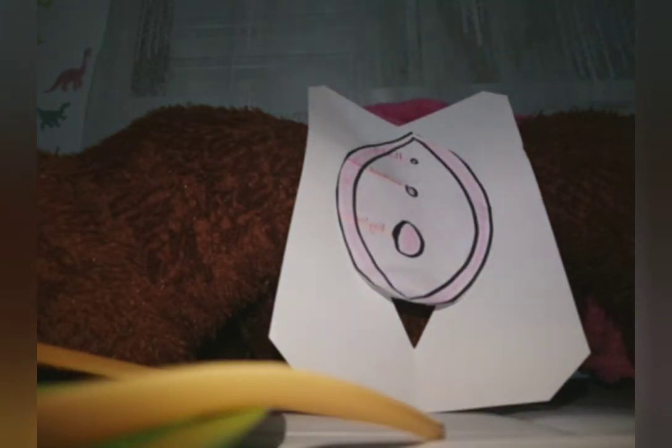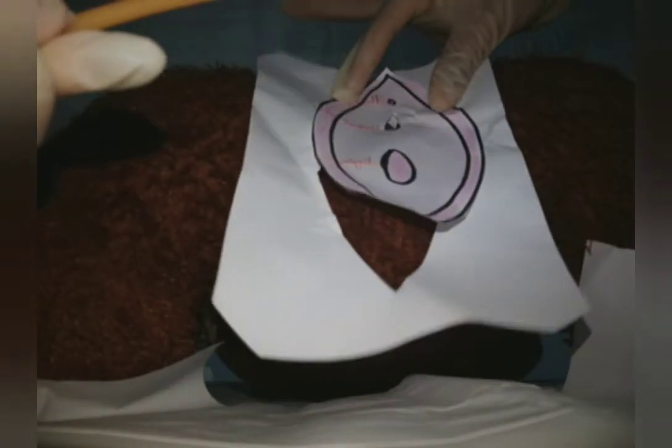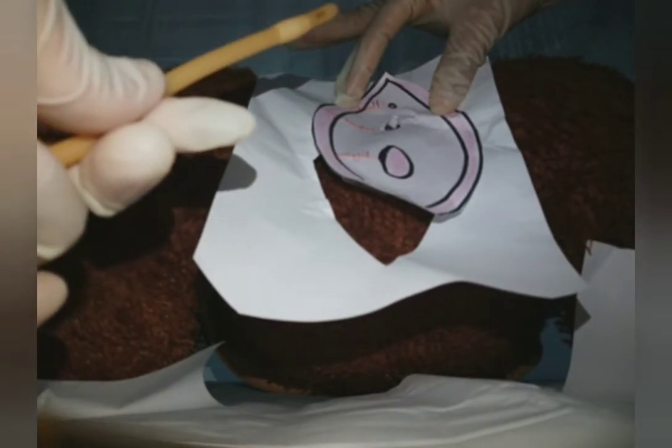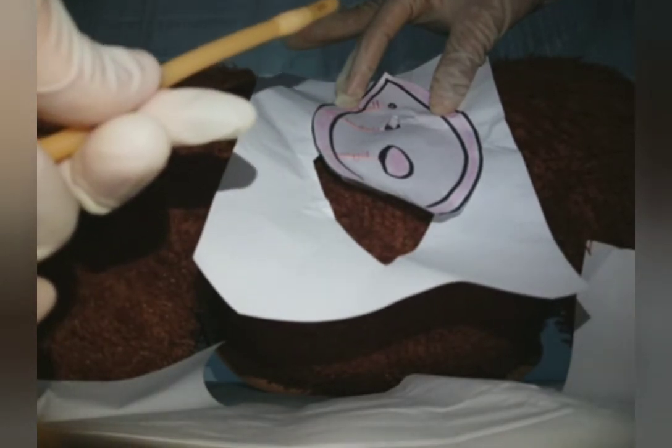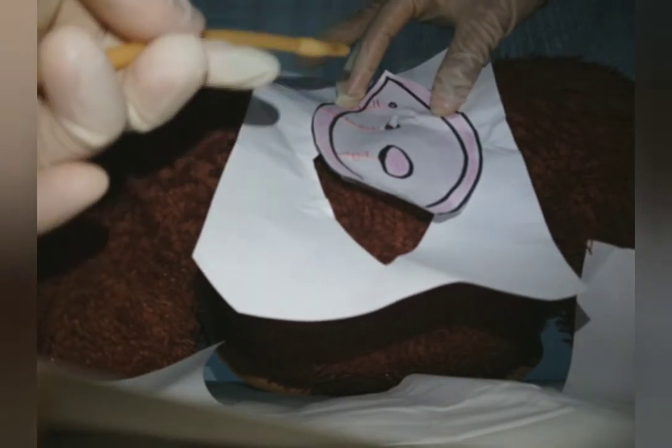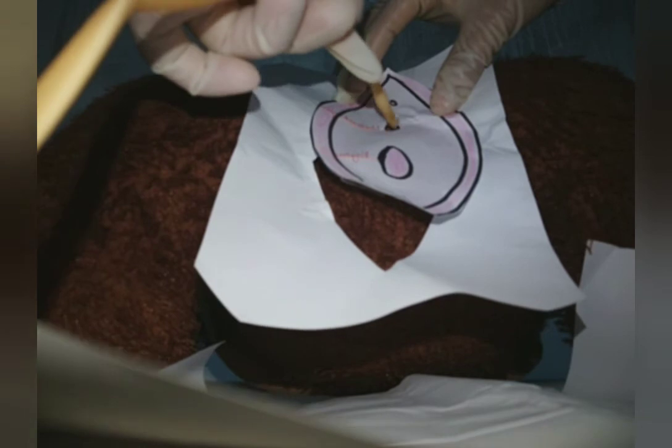Now the catheterization insertion time. Mom, when I insert the catheter into your urethra, you just take a slow deep breath, which can help you to ease the pain. It is painful, but it's bearable, mom, so hope you will cooperate with me. I will hold the catheter 3 centimeter below the tip of the catheter to maintain the sterile field with my dominant hand. So mom, I will now insert the catheter into the urethra.